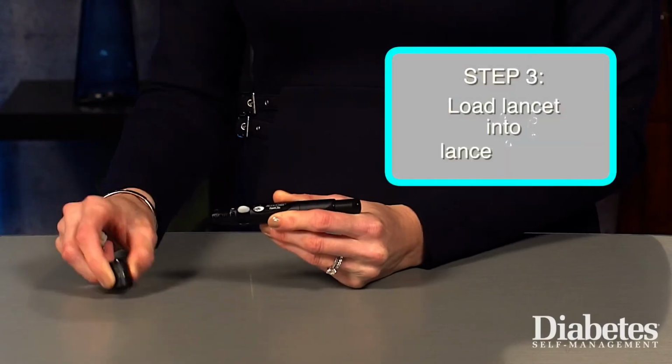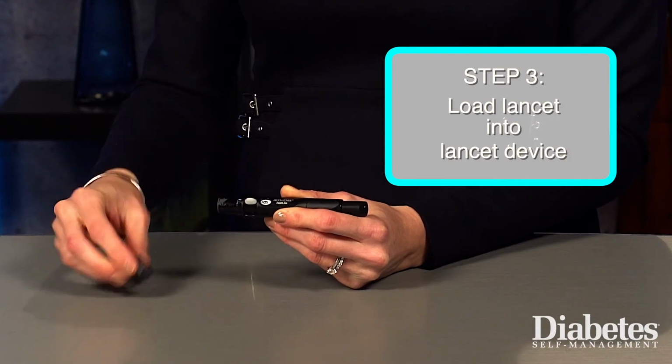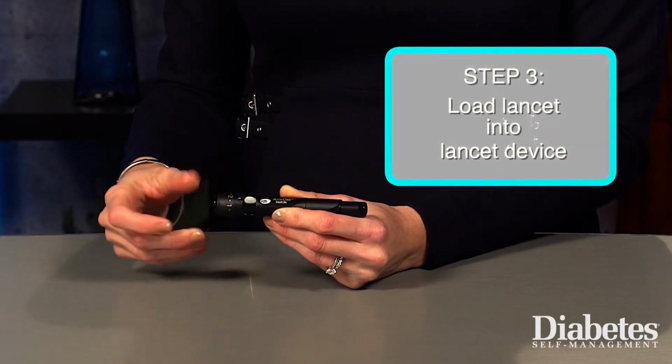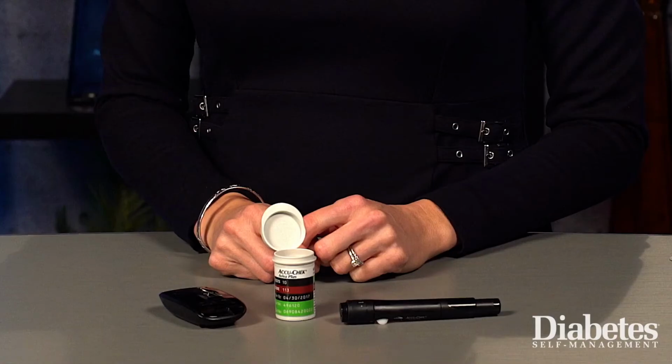The third step is loading the lancet into the lancet device. The lancet is the tool used to prick your finger for the blood sample. Lancet devices can vary slightly, but typically are spring-loaded gadgets into which you will load small needles. On most devices, you can adjust how deep you want the lancet to prick you. The higher the number, typically the deeper the prick to your finger. The lancet should be changed for each finger stick.